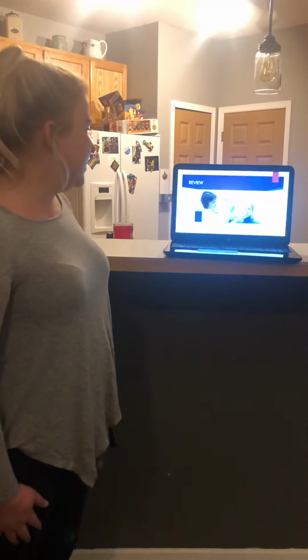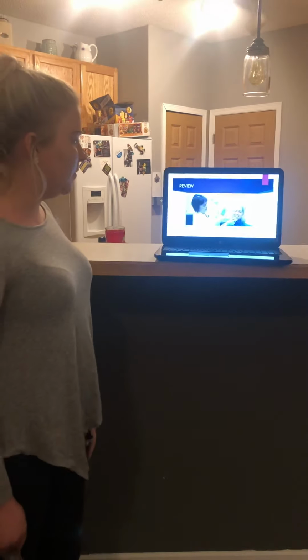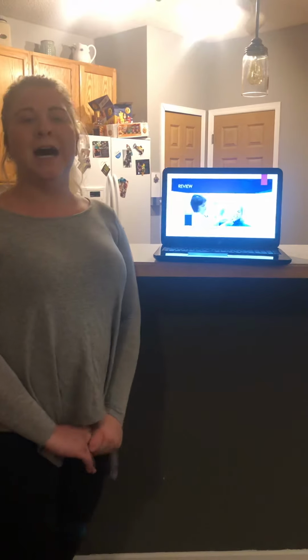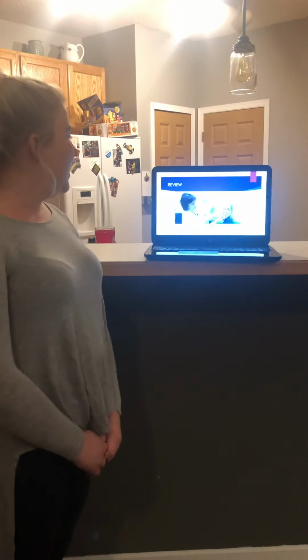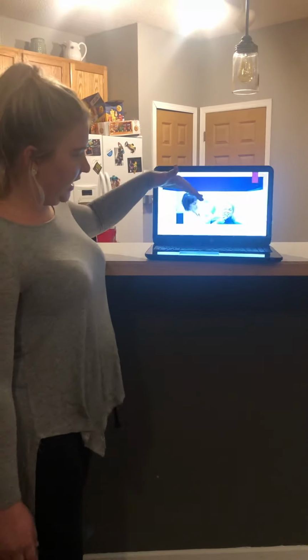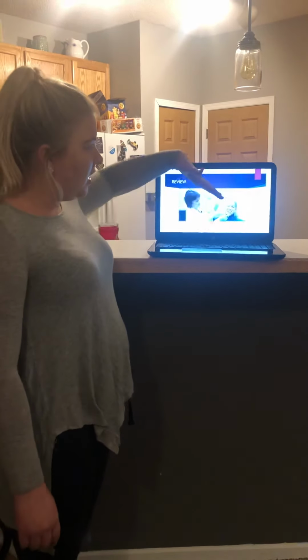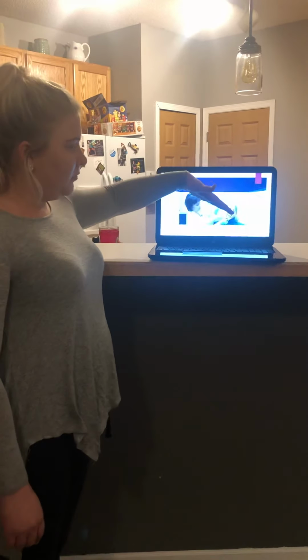And then last question, so this hygienist is taking a picture of this woman's teeth here, and what type of vertical angle is being shown in this image? Thomas. Positive vertical angle. It is positive vertical angle. That's very good. So we are showing here that we're taking a periapical, and she is using positive vertical angle by having the PID above the patient's face in line with the film sensor.